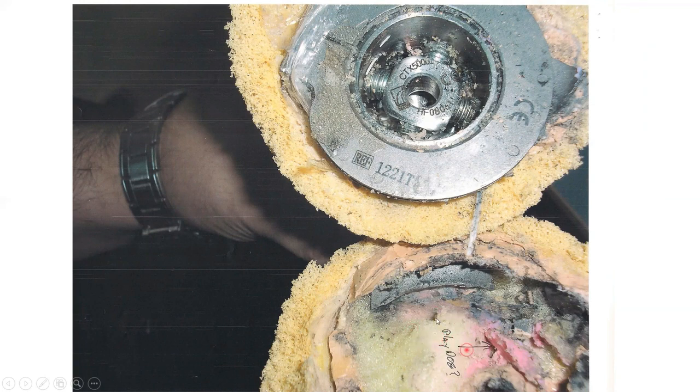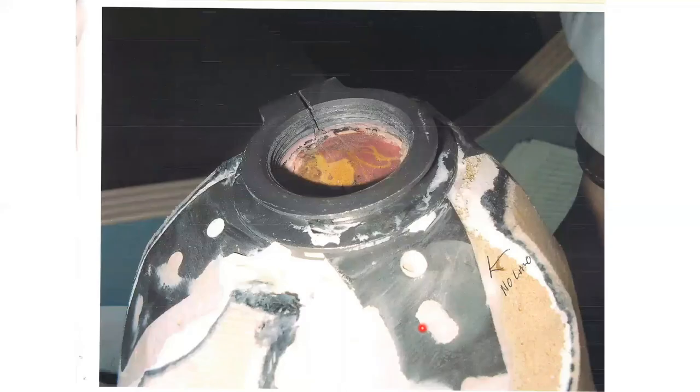It'll start to microfail, and then you get micro motion of the part, because now this is going to move. Even though it's a micro movement, over time, it's repetitive. It's like getting a piece of aluminum and bending it back and forth many, many times. Pretty soon it'll crease, it'll start to fail, and then you can break it in half. So you can see how there's a clean snap here, and that's from micro movement and fatigue failure. That's from putting this component on foam, which has no structural value, especially at the bottom of the socket. It should have been laminated.